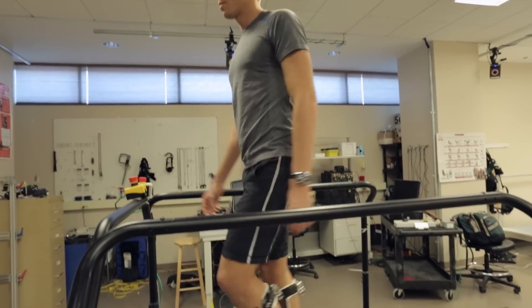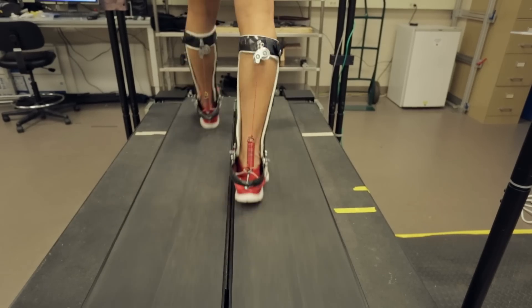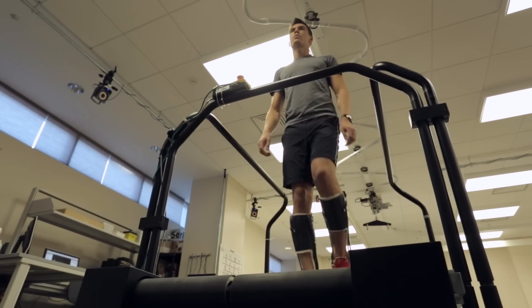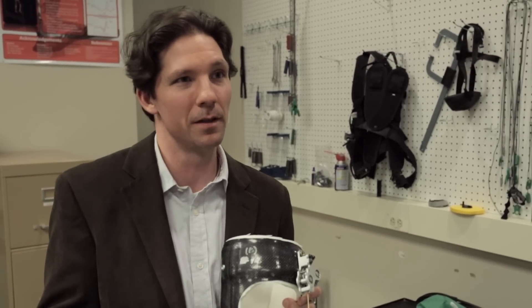By transferring mechanical energy to and from the person strategically, we could reduce the forces in the person's calf muscles and actually reduce their energy cost by about 7%. Now 7% is actually appreciable — it's equivalent to about a 5 kilogram backpack, so about 10 pounds in a pack.